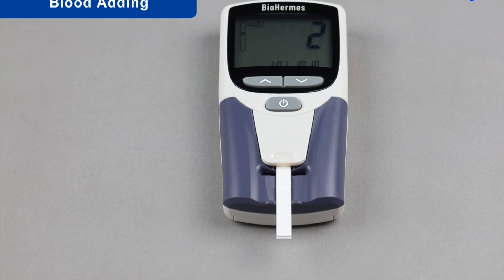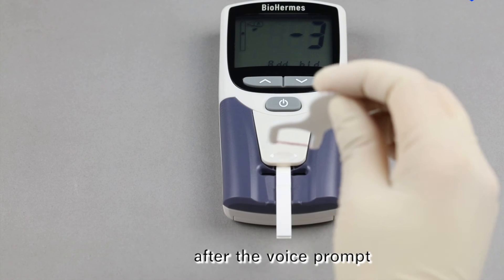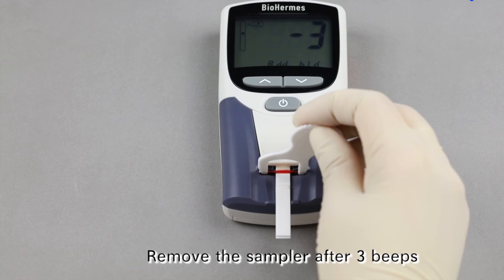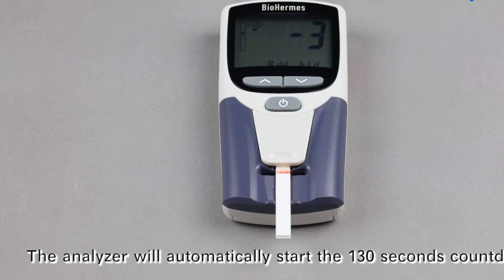Blood Adding. Add the blood sample to the sampler port within 5 seconds after the voice prompt. Remove the sampler after 3 beeps. The analyzer will automatically start a 130-second countdown.